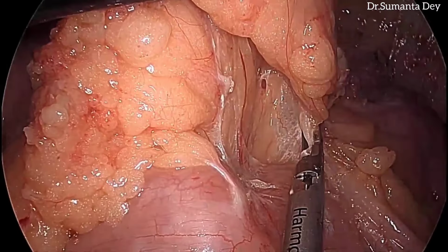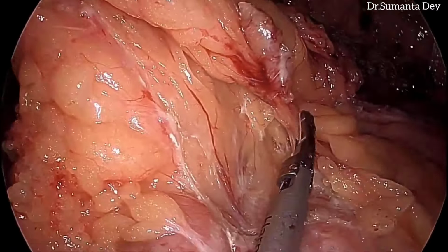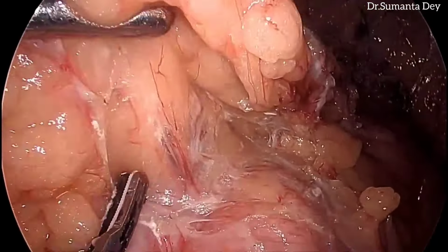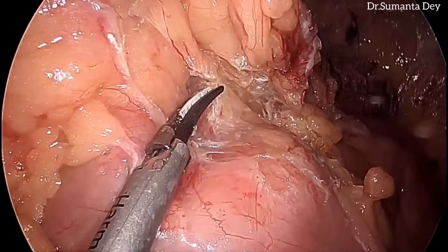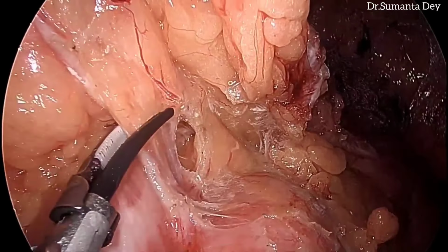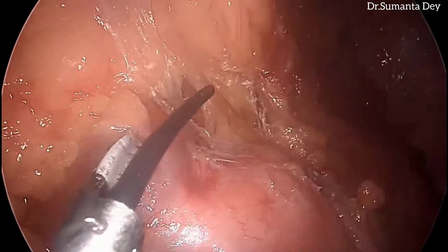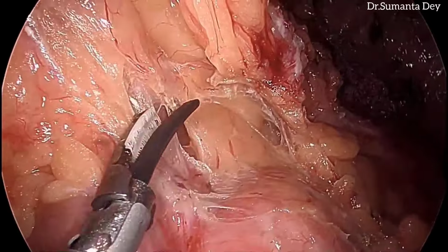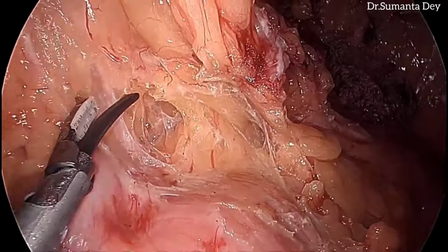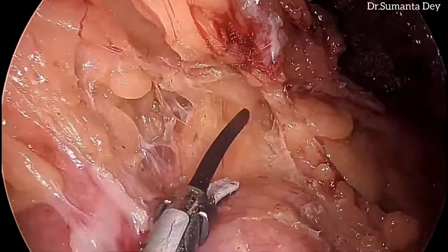lesser sac from there. So this part of the dissection is very important, because sometimes with the bulky greater omentum you may tend to lose the plane, and then it is very difficult to identify and get into the correct plane. So staying close to the transverse colon is the key, and divide the greater omentum and reflect it away from the colon, and gradually you will be entering into the lesser sac.